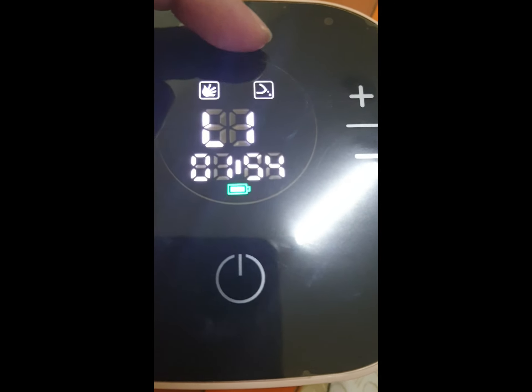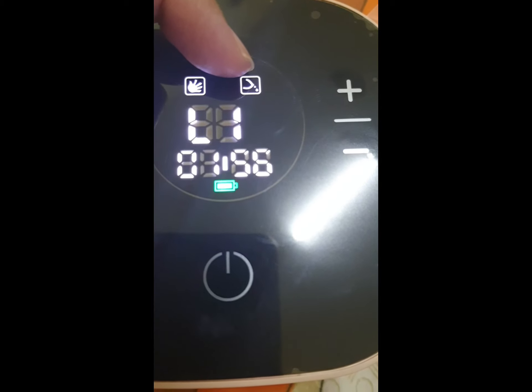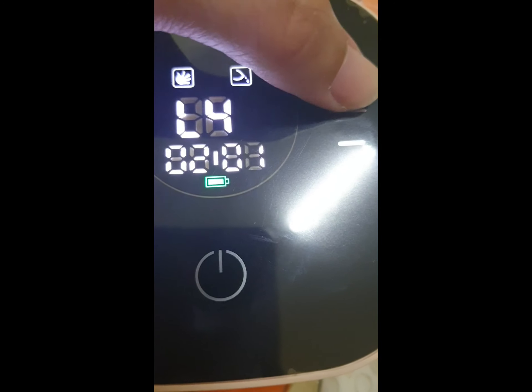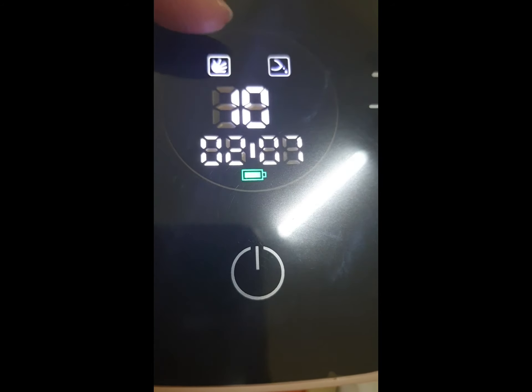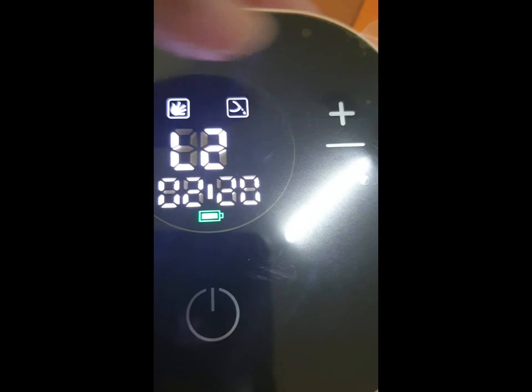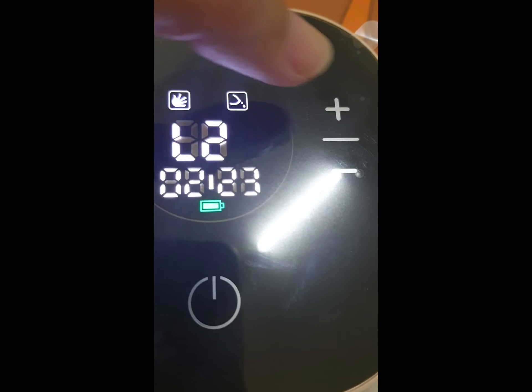...it has 10 massage cycles plus the 11th one is one expression suck. When you're on level 10, it has already one massage, one expression, one massage, one expression. So every time you increase a level from level one — that's 10 massage to 1 expression — then level two is 9 massage to 1 expression.